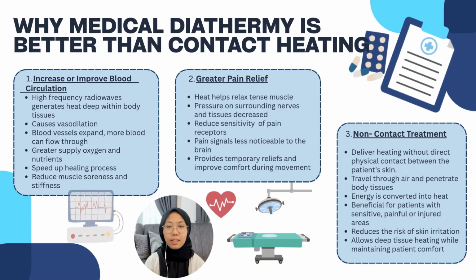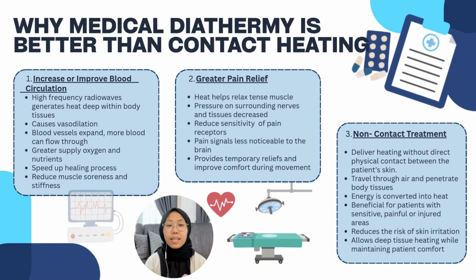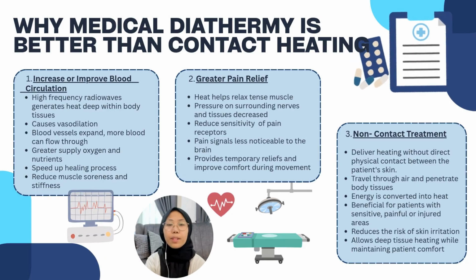Why is medical diathermy better than contact heating? Medical diathermy is considered better than contact heating because it can generate heat deep within the body tissue using high-frequency radio waves. Firstly, it helps to improve blood circulation.